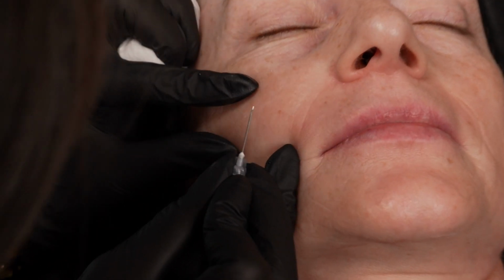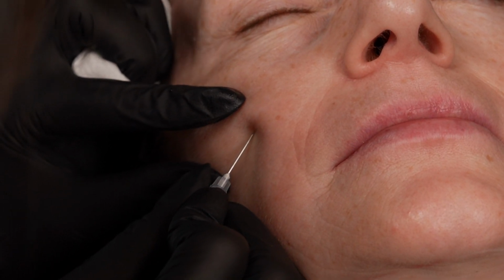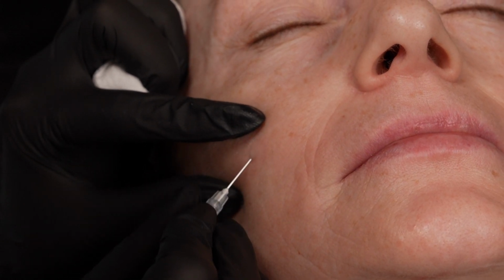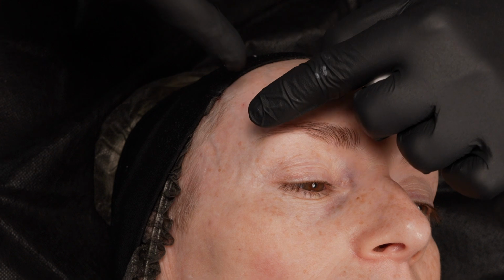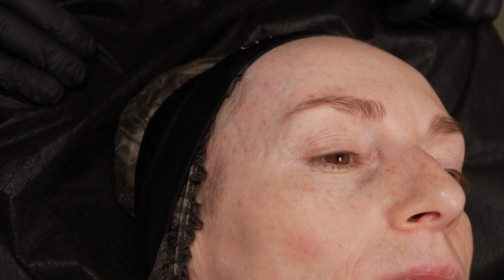She is not doing that perpendicularly. In general, when you make the puncture, okay, you can do it this way, but until the dermis. Here you don't need to do perpendicular, but here you need to, because you have to go till the bone. But here you don't need. If you plan to change the cannula direction later to the opposite, then it's better perpendicular. If you only work in this direction, then it's better to angle it. I always used to do it at a 40-degree angle. If you open it like this, you cannot go till the bone, then you cannot find the interfascial plane. This is important only on the forehead, because we need to reach the deep layer.